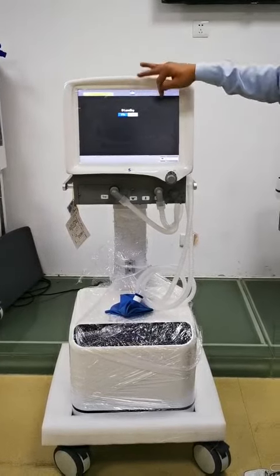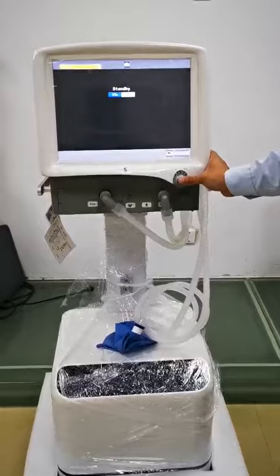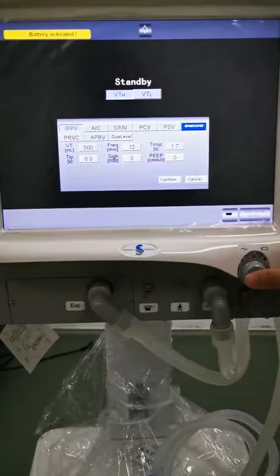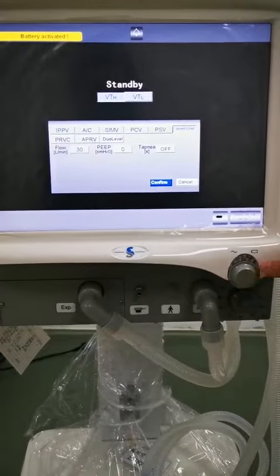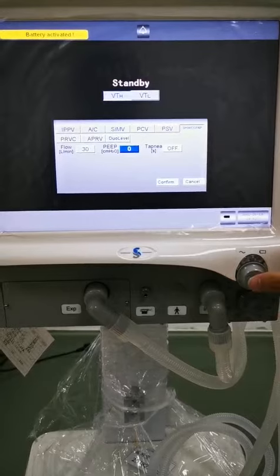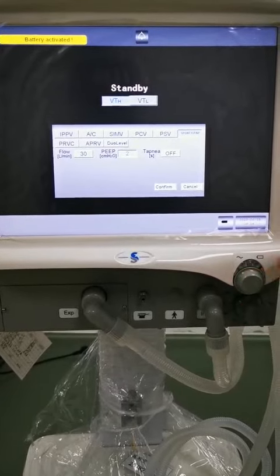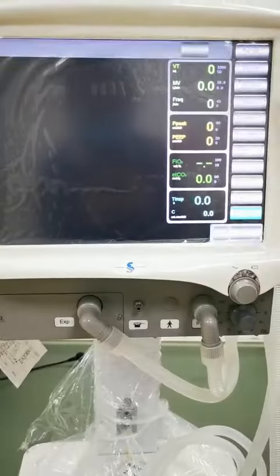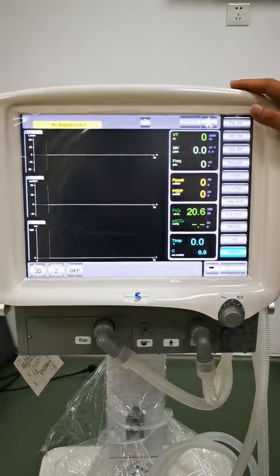Enter into the standby interface and choose the VTH, CPAP, and spontaneous ventilation mode. Set the PEEP to 2 cmH₂O and confirm. Then it will enter into the working interface.